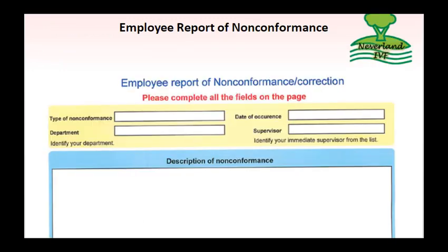Documentation is all electronically recorded, and all reports in the nonconformance database have 3 steps. First, the error or problem is entered into the database, generally by the employee who committed or discovered the error or problem. A full description of the nonconformance is recorded, including all relevant information.